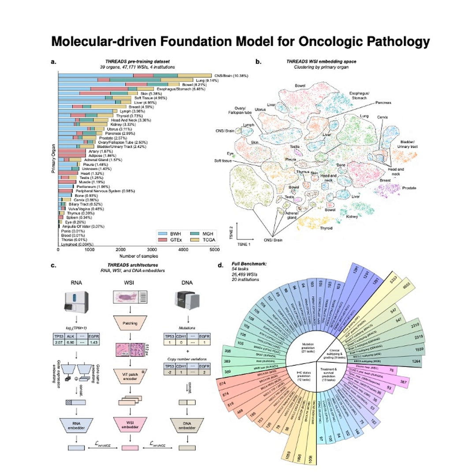And this efficiency carries over to something called few-shot learning as well. Few-shot, meaning learning from just a handful of examples. Exactly. It's a measure of how well a model performs when you give very, very few training examples per class, maybe just 4 or 8 or 16 examples. And how did Threads do there? It excelled. For example, in a task involving subtyping rare brain tumors, Threads achieved higher accuracy using only 4 samples per class, they call this K4, than its closest competitor, PRISM, managed even when using 16 samples per class, so K16.